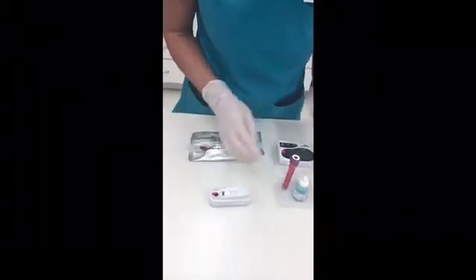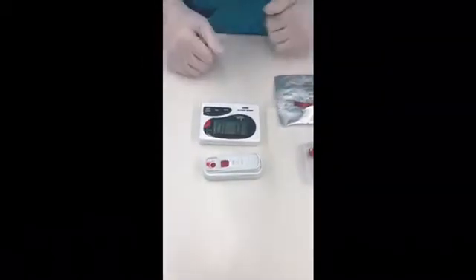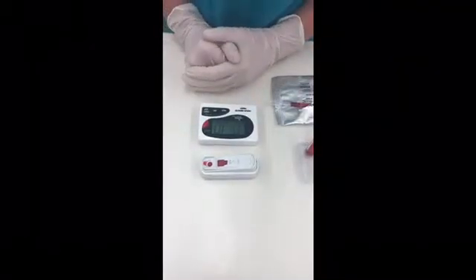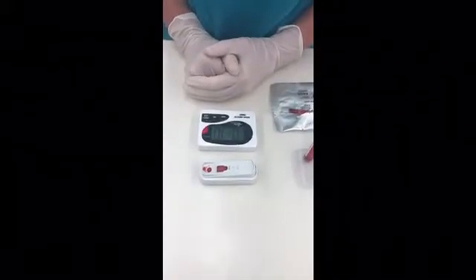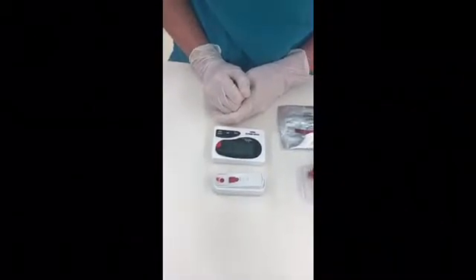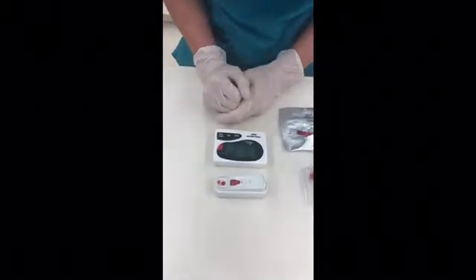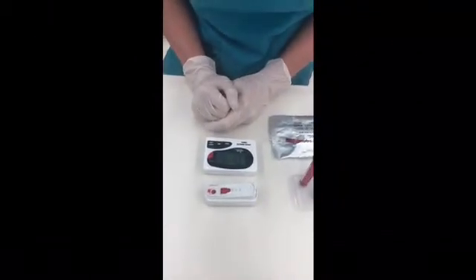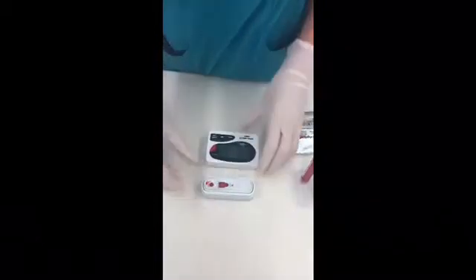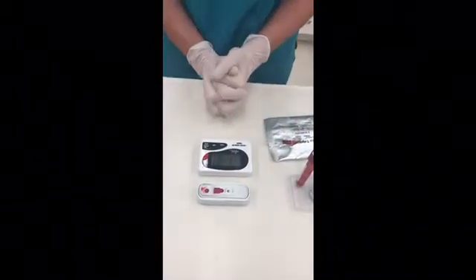All right, it's going to slowly creep up here. And you're going to wait till it gets to this little window, and as soon as you see the sample in the window, you're going to snap the test down and then start the 10-minute timer. And you do want to make sure that this is on a horizontal, flat, sturdy surface. It's almost flowing across the result window here. All right, so you can start to see it in that little window, so I'm going to go ahead and snap it down, start the timer, and when that test is done, we'll be back.